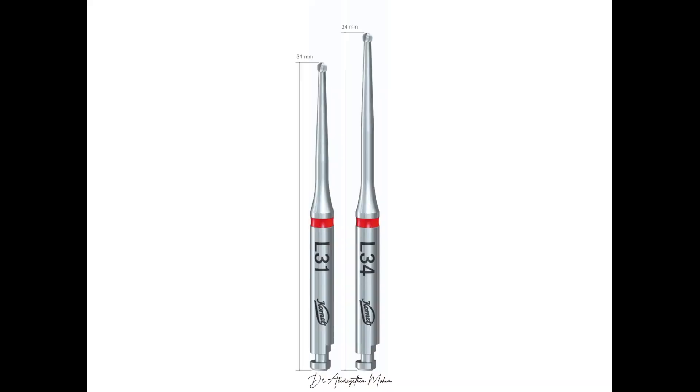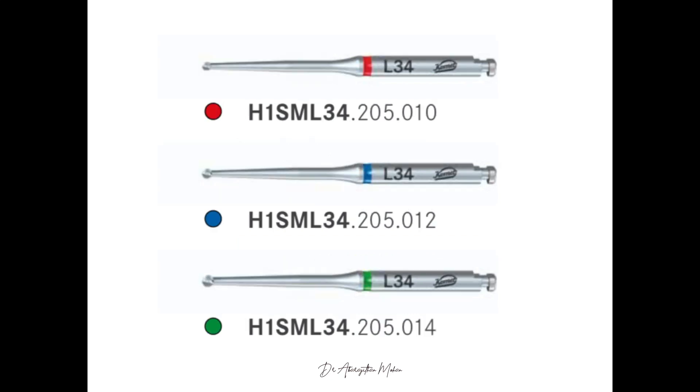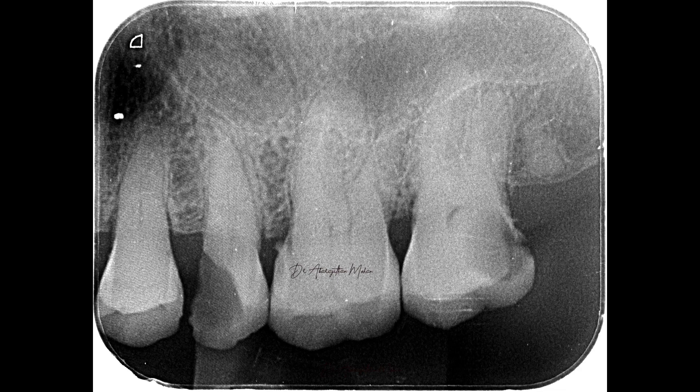Each size comes in two different lengths: 31 millimeters and 34 millimeters. The color coding goes this way — the smallest one is purple and the largest one is green. Depending on which tooth you are working on and the level of root canal you are working at, you can choose the size from small to large. There are no particular indications for the sizes, so I'll show you some clinical demonstration.